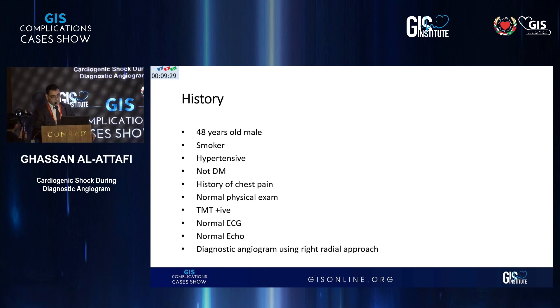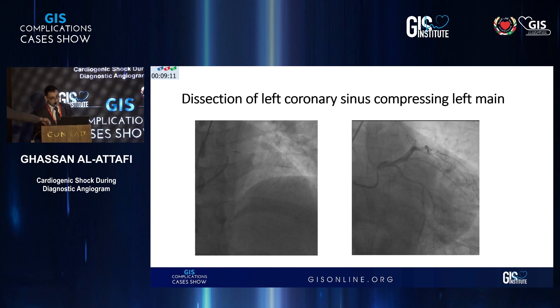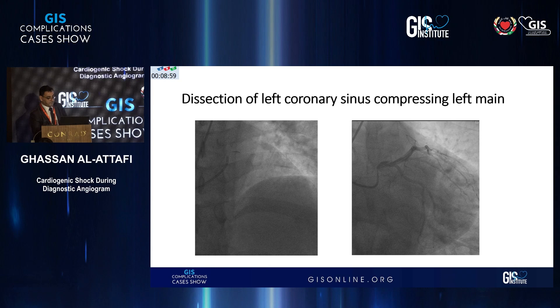The angiogram was done by my colleague who has recently started his learning curve in radial approach. The angiogram of the right system was normal — RCA dominant and clear. The left system was also normal. But the operator noticed a crescent line near the ostium of the left main, and on a second view after further injection, that crescent area became more evident. It looks like a dissection that expands after further injection.